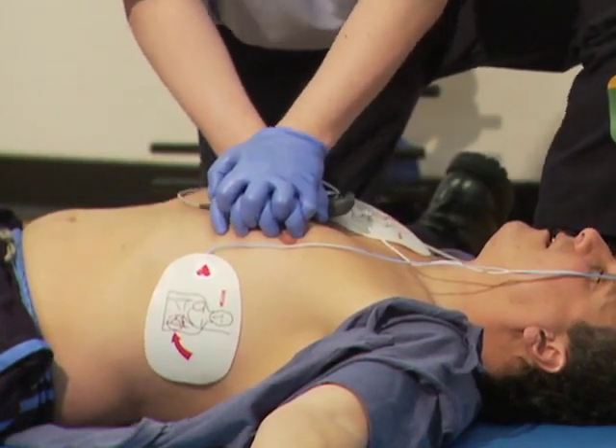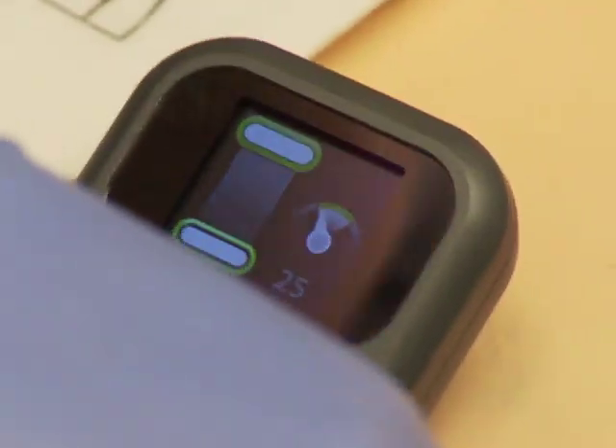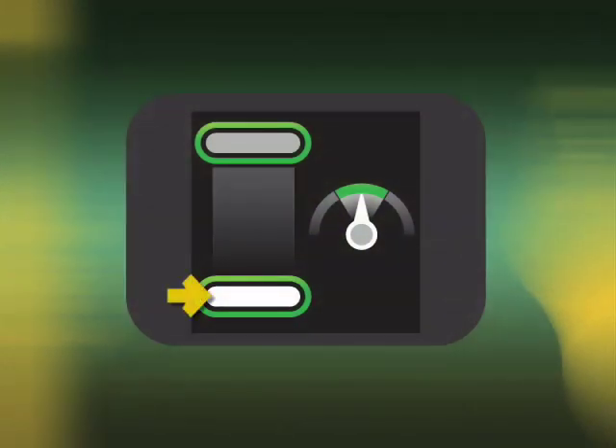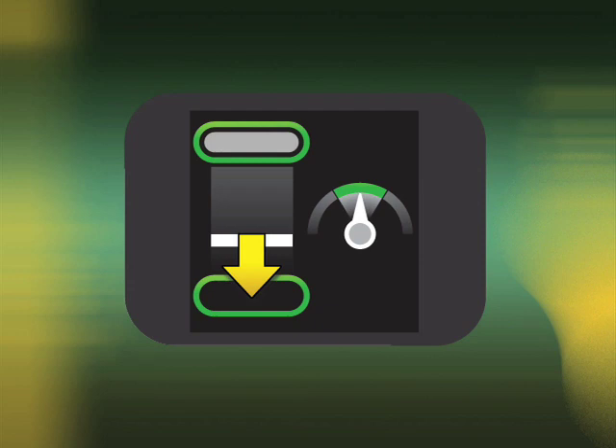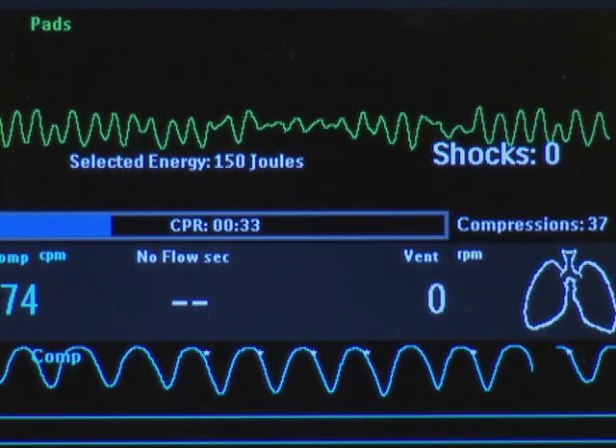Each compression performed is represented on the CPR meter display by a moving white compression depth indicator bar. When the CPR meter detects that a compression meets the target for depth or release, the target illuminates. If the CPR meter detects a compression that fails to meet the depth target, the area does not illuminate. If this yellow arrow appears, this indicates that four consecutive compressions have failed to meet the depth target. If the compressions continue to miss the target, the MRX provides a corrective voice prompt: "Compress deeper."